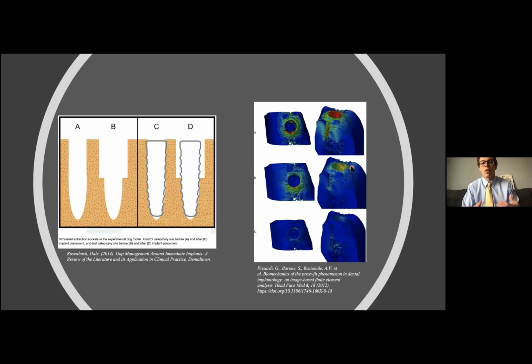There's a technique called a delayed immediate implant, in which the osteoid, or immature bone, has already started to form when they place the screw, and that really catalyzes bone development. So even if it was a little under-contoured, if you had good contacts in some spots, it would still probably integrate just fine. And if it was over-contoured, a dentist, having studied tooth morphology and anatomy, could shave down the high areas and make sure that it fit their needs.